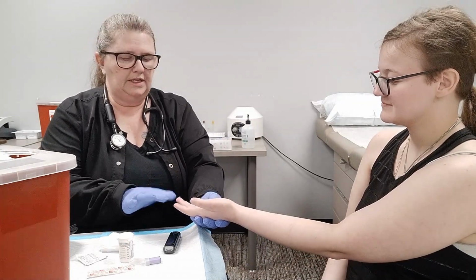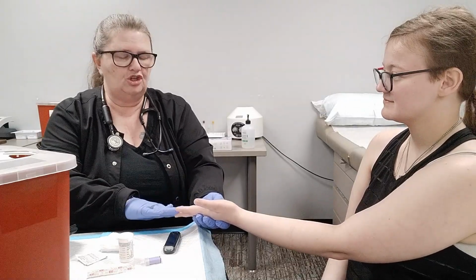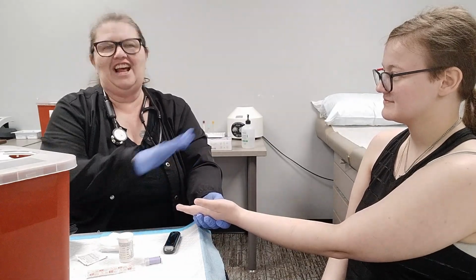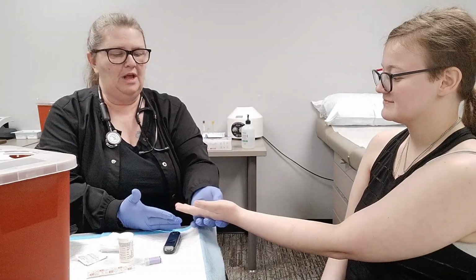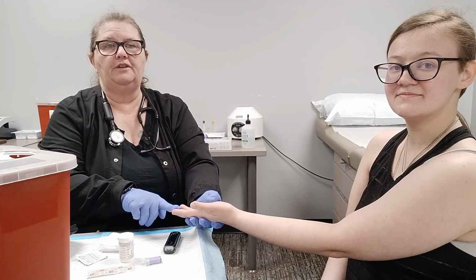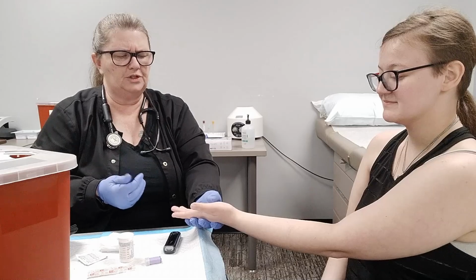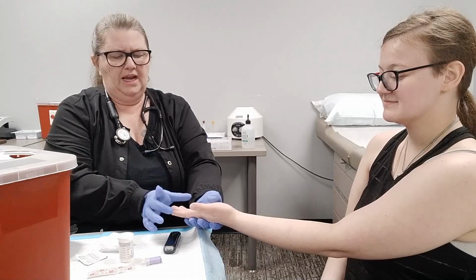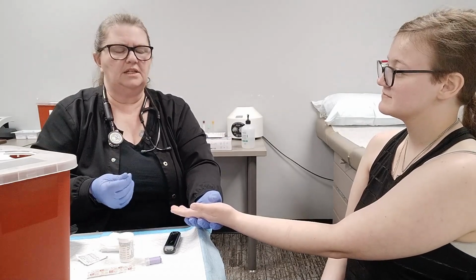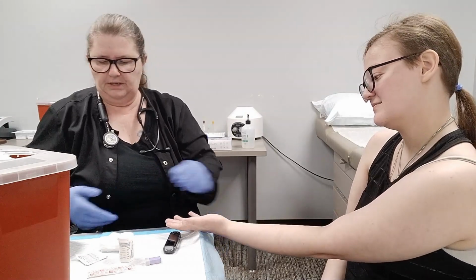What we want is a nice, clean, non-injured, non-scarred, non-calloused finger, if at all possible. The best fingers to use are the third and fourth digit, or the middle finger and the ring finger. They're a little meatier than the others. You don't want to use a thumb, and you don't want to use a pinky finger. It's too small. And the index finger, we just use that a lot. So better to use the others. We're going to go ahead and use her middle finger, I think.